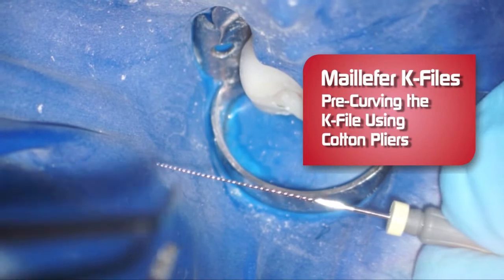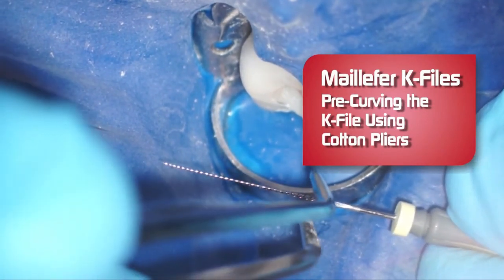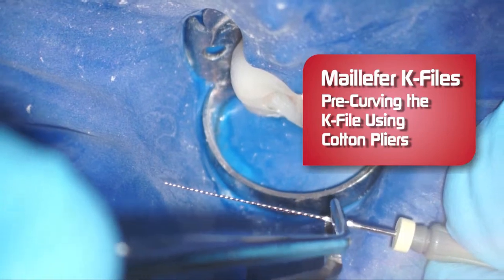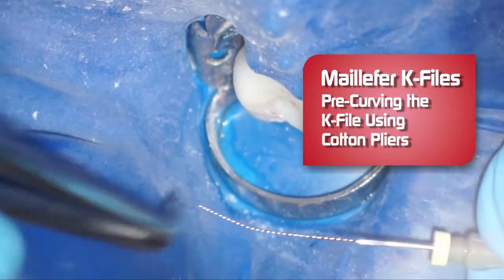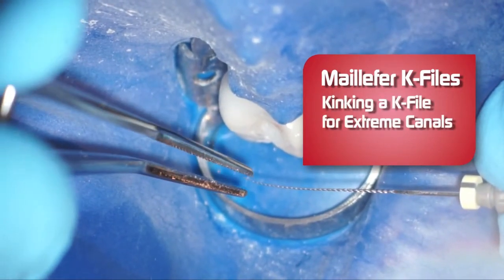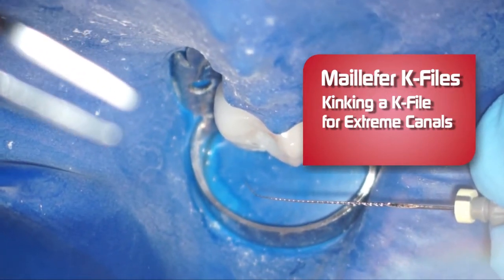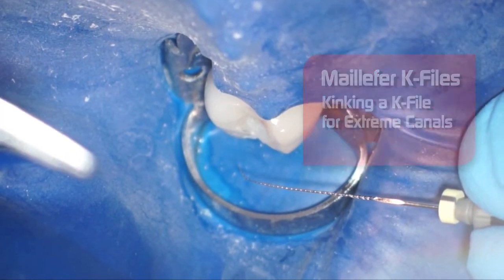What I like to do with K-files sometimes — this happens to be a number eight — is pre-curve the file in order to get into a dilacerated canal like an MB2 canal. I like to take some cotton pliers and just gently curve the file without affecting the integrity of the file. You've got a little curve there, and it's easier to introduce into the canal. For an extremely dilacerated canal, I like to put a little kink in the end of the file, just like that, and it allows you to negotiate a very dilacerated canal or an MB2 canal with greater ease.